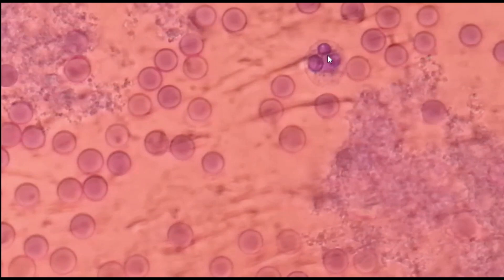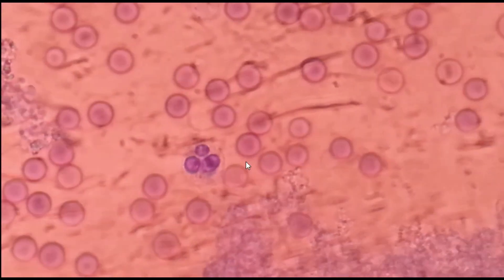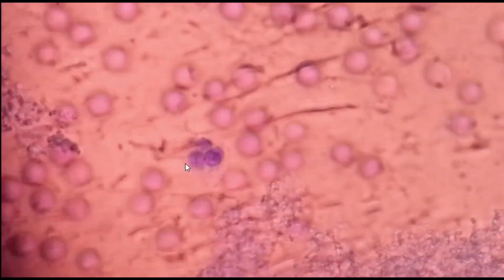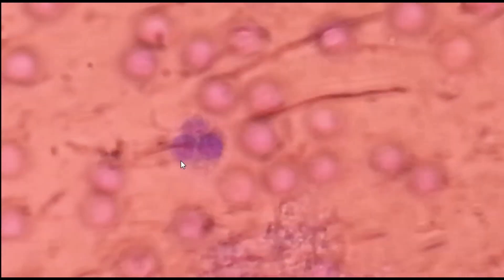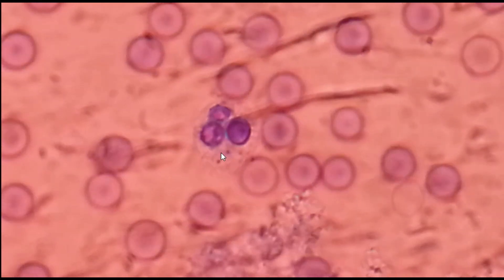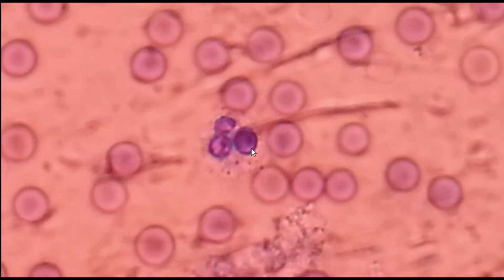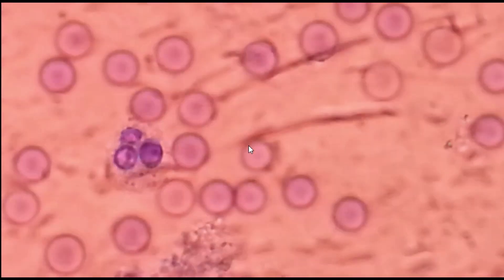This one is the neutrophil. We can see three lobes of the nucleus inside the polymorphonuclear cell, and there is also presence of granules inside it. Yes, this one is the neutrophil.